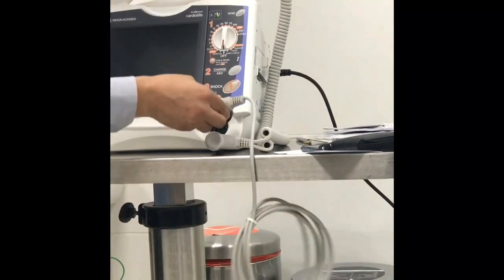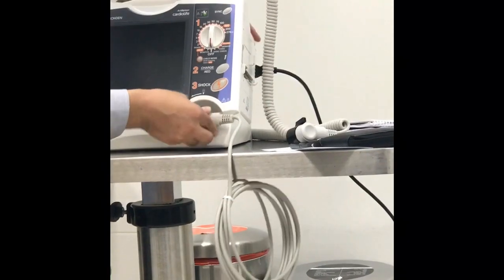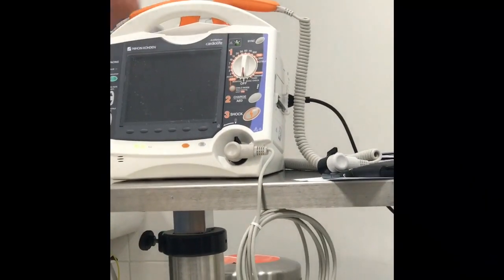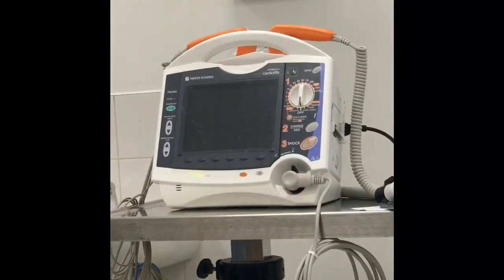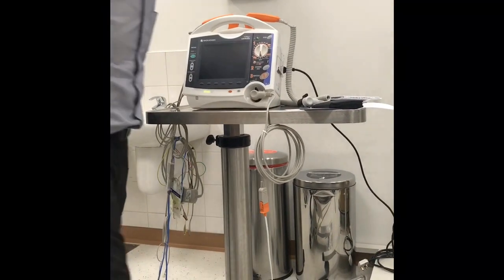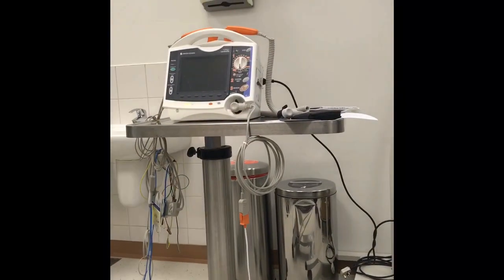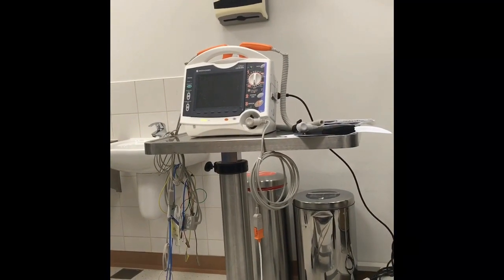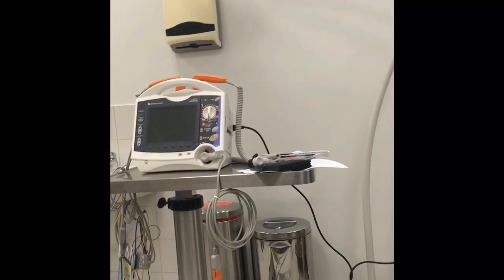Okay, I will go now to the software. Any questions before going to the software? How about the test load for this? The test load? Is there any test load? Yeah. Operational check? Yeah, there's an operational check. You can do it from here. So, basic check. Even without the test load, it's good. You can do the operational test without the test load. It's okay. You can do it from the basic check.